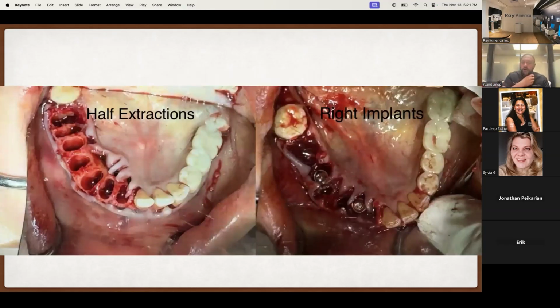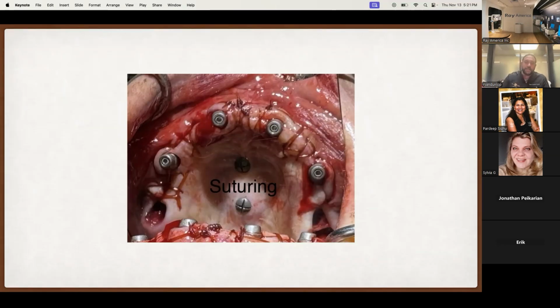On the lower jaw, I tend to do half of the jaw first and then the other half. The reason for that is I don't have a palate like on this. If I go back a slide, on this I have that home base of those 2 screws on the palate. Those act as our scanning base so that we can link our pre-op scans to our post-op scans. Even though everything in the mouth changed, the position of these 2 screws did not.